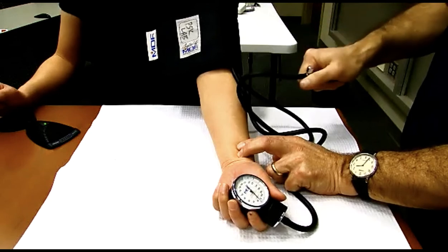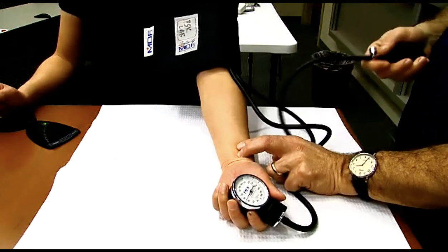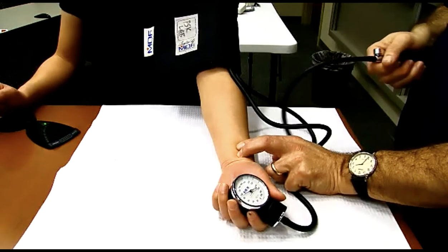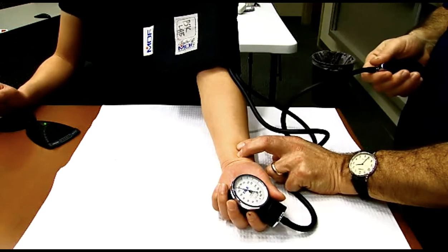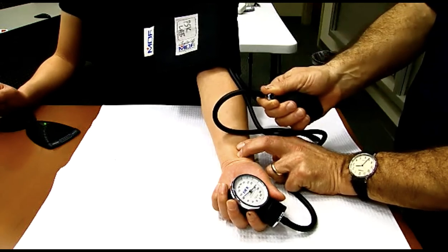So I squeeze and I squeeze and I squeeze. And you can see the pressure gauge starting to go up. It's about 60. I can still feel it. But now watch. If I do a squeeze, it jumps up a lot. It went away. But that was a big jump. So now I know I've exceeded it. So I'm going to use my valve here and slowly release the pressure until I can feel it again.